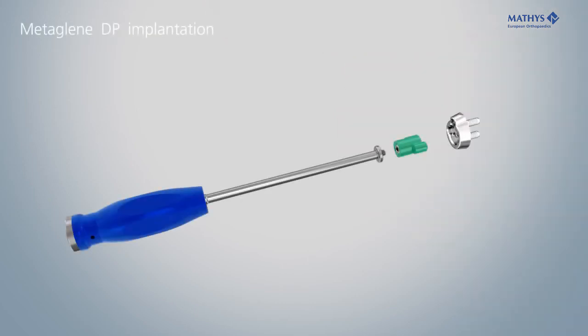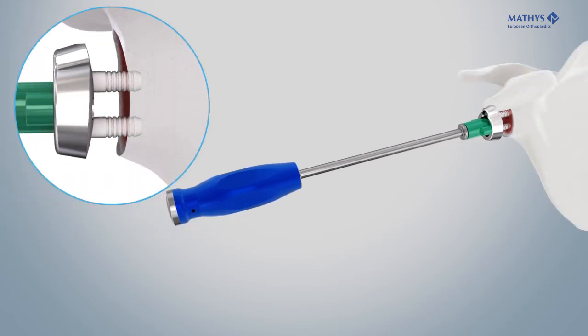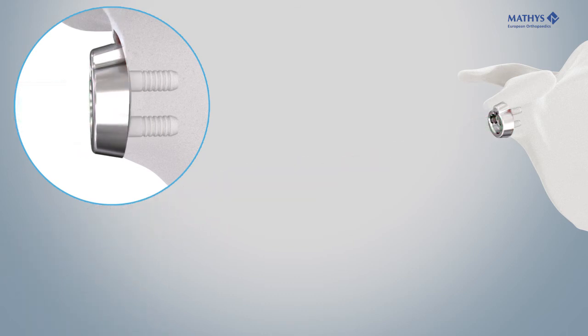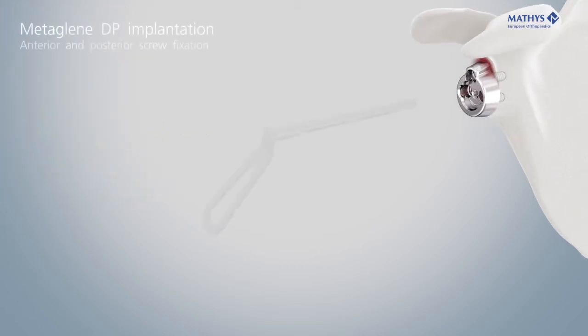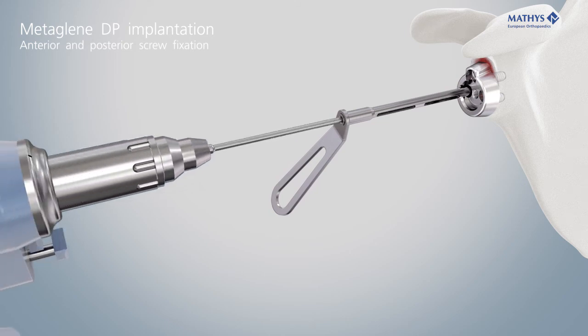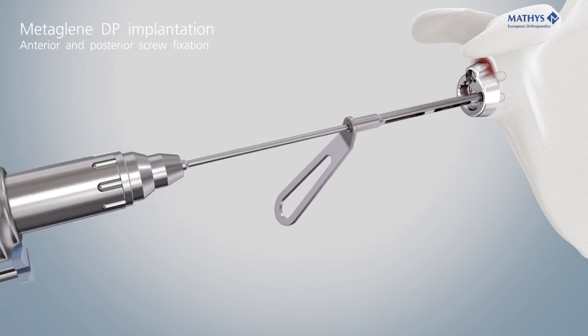Screw the adapter onto the impactor and place the metaglene onto the adapter. The metaglene is implanted with carefully controlled hammer strokes until it abuts flatly on the resected glenoid surface. Hold the drill guide into the screw holes in the metaglene and drill the holes for the screws in parallel or slightly convergent orientation relative to the pegs of the metaglene.